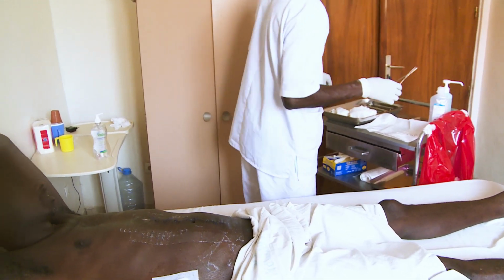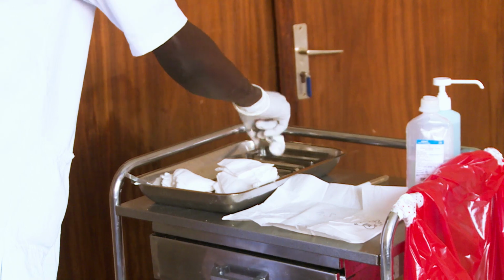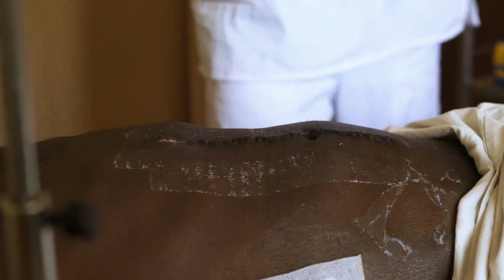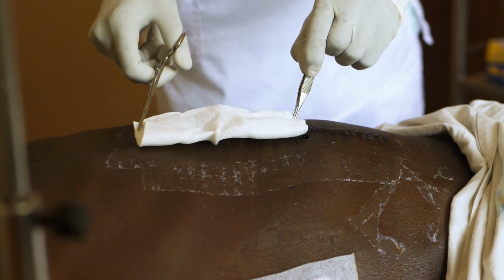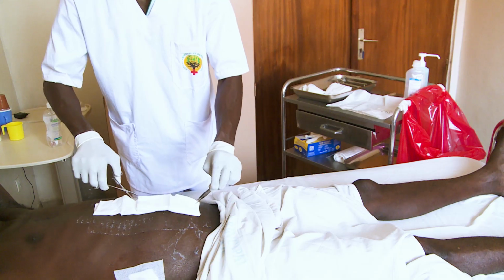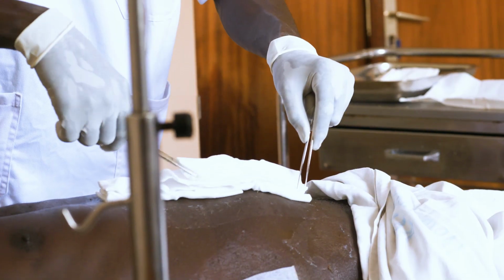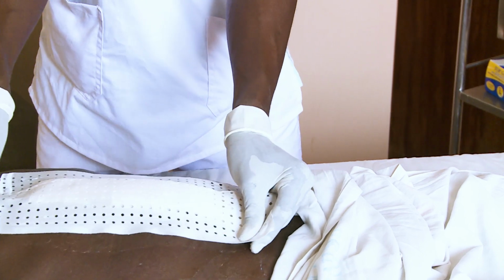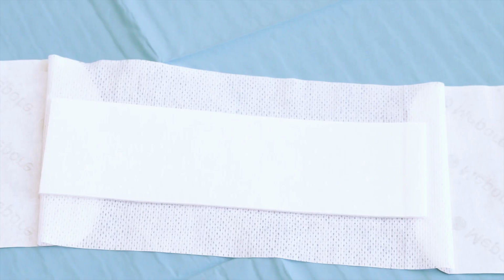If the wound is not fully healing by primary intention, or the wound is potentially or confirmed infected, then a new dressing should be applied as follows. Using a new set of sterile forceps, carefully place the sterile gauze directly onto the patient's wound. Then measure the required adhesive based on the size of the wound and apply over the top of the wound. This type of sterile, non-adherent, pre-prepared dressing is more appropriate to optimize wound healing if available.